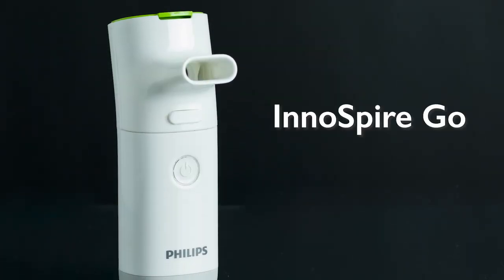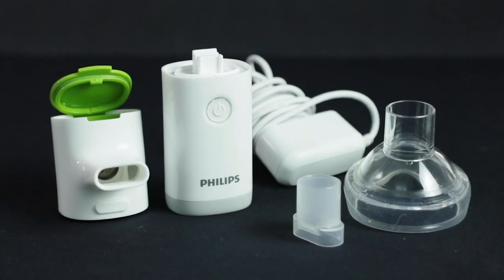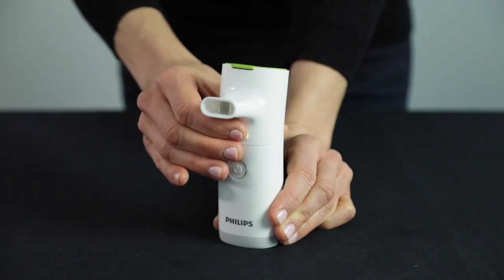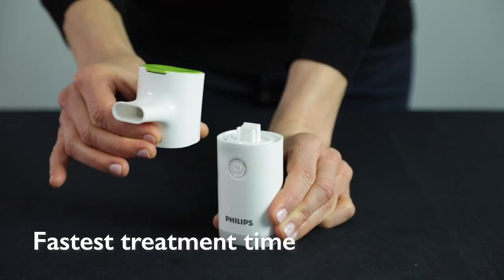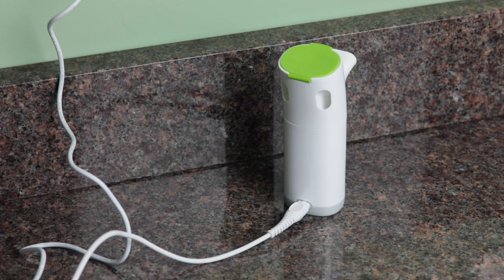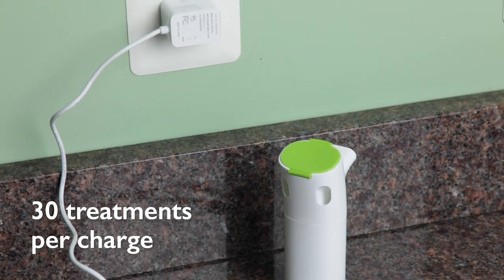Last, the Innospire Go by Philips Respironics. This unit is another simple design having really two main parts: the mouthpiece and the handset. It is the fastest with a treatment time of about four minutes. You charge the unit just like you would a cell phone and it provides up to 30 treatments per charge.